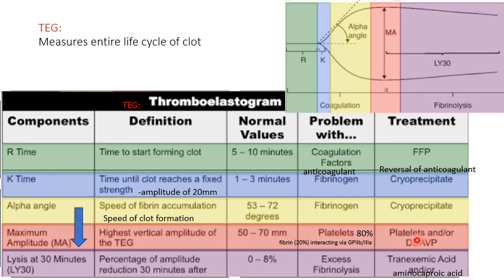you may have to think that in 20% of cases it could be because of a GP2B3A inhibitor, like we give when the patient is, suppose, an MI patient or a CAD patient, or came for stenting and a GP2B3A inhibitor is going on.